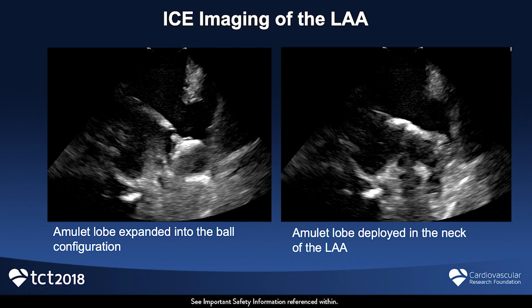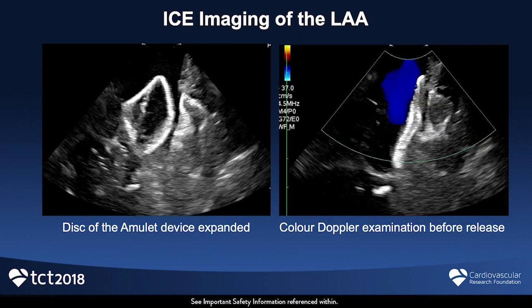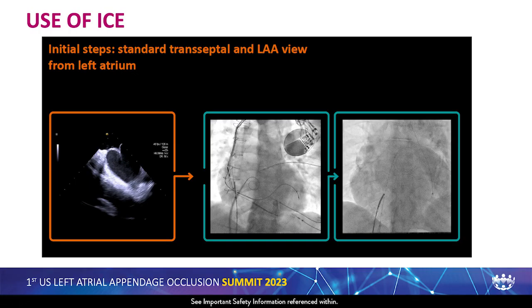So this is another example of ICE imaging. This is a 2D ICE actually. You can see the ball out here. This is a deployment and the disc. This is the transseptal puncture we went through.